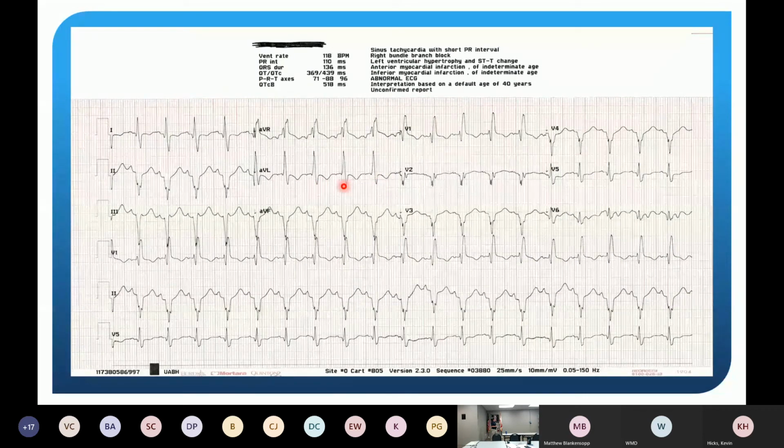All right, so this is a woman who passed out, had bystander CPR, probably about 10 minutes, got a couple of shocks because she was in VFib and woke up, was confused, and couldn't tell us a lot. So the rate's okay. I said the rate is fine.